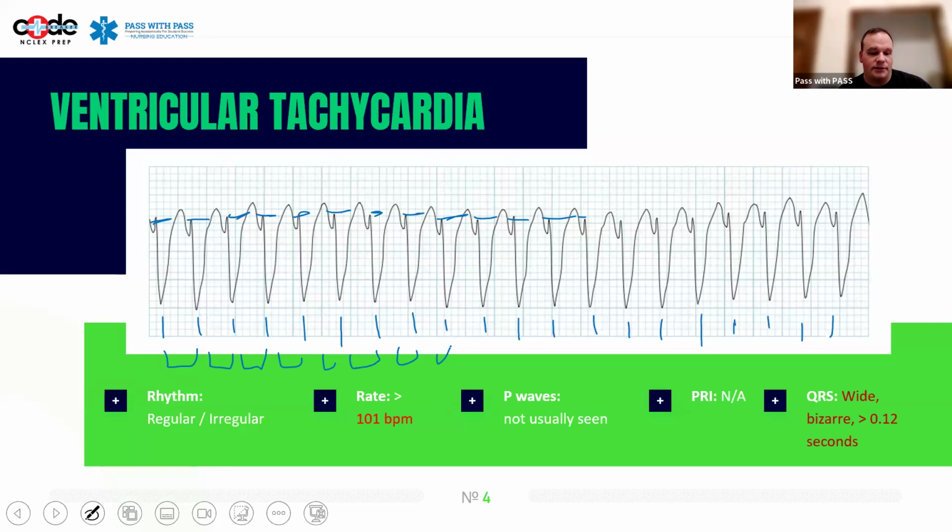But the other thing is, if you're doing hands-on labs in the paramedic program, like static cardiology and dynamic cardiology, and your instructor changes the rhythm strip or they hand you a new rhythm and it's VTAC, the very first thing you need to do is ask, is there a pulse or no pulse, right? Because that dictates how we treat this rhythm. Am I putting it in my cardiac arrest bucket, which we'll talk about in 2 weeks? Or am I putting it in my tachycardia bucket, which we're going to talk about tonight?